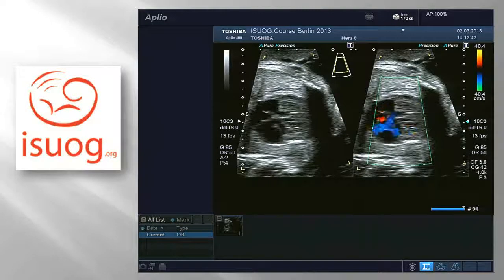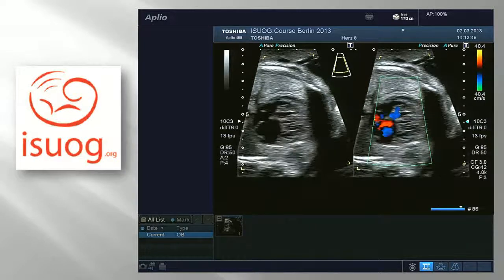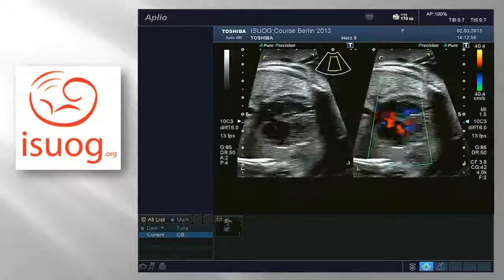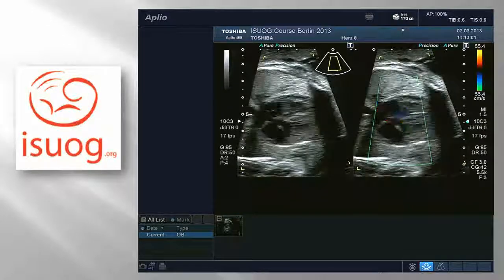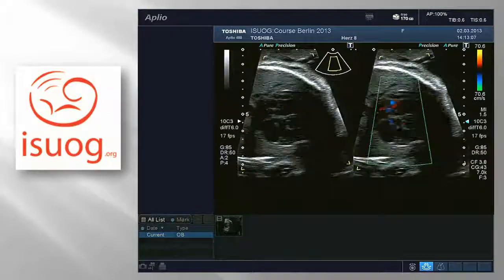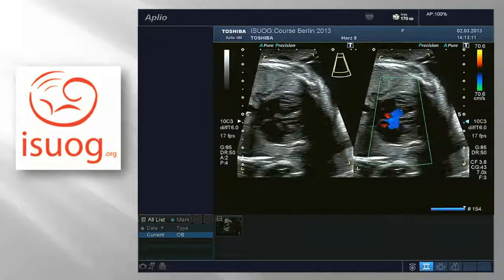So we have here picking up more the filling of the right ventricle rather than the left ventricle, because in the left ventricle we're already picking up some of the outflow tract. Velocity range. This one. Yeah. We need to increase this here because 40 centimeters per second was a bit low. So normal color velocity across the aorta.